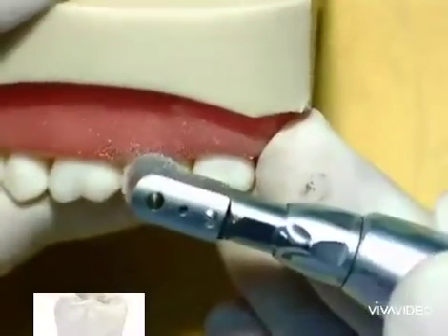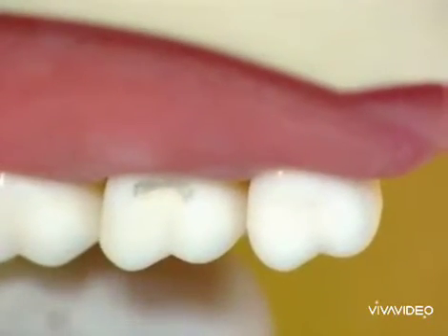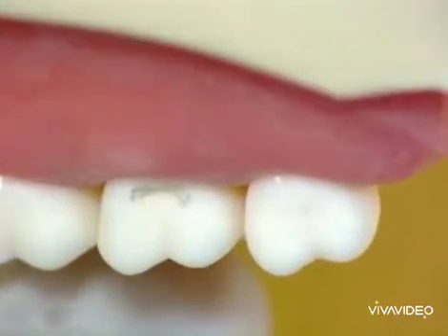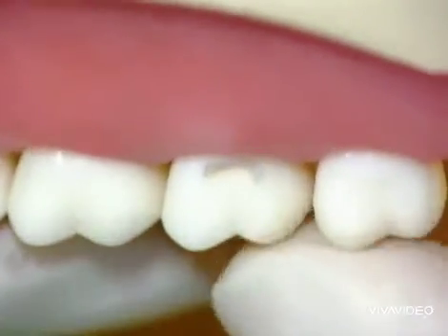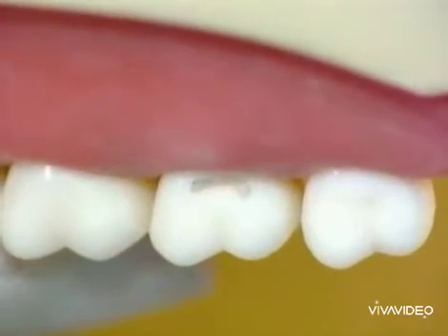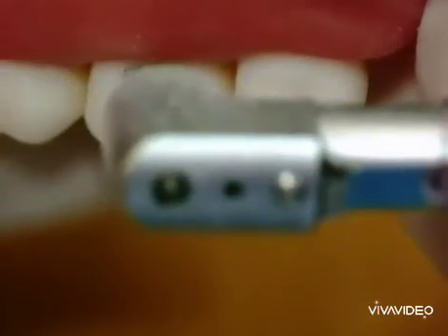The demonstration here is on the upper second molar. This is the outline form. The depth of the cavity is 1.25 mm. The cavity should be as conservative as possible.